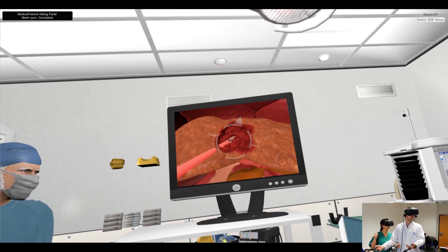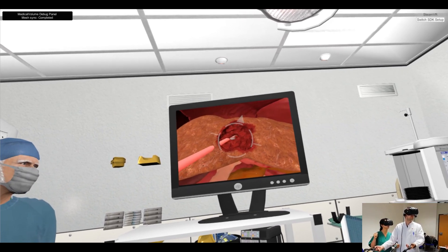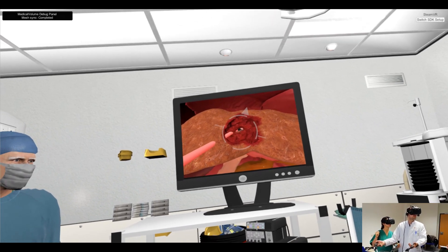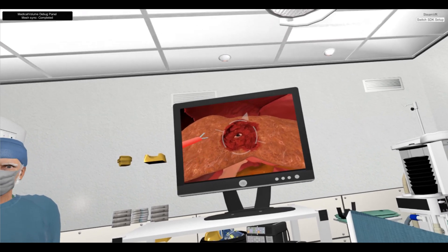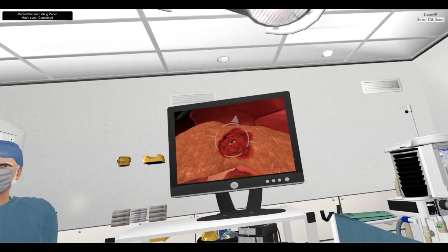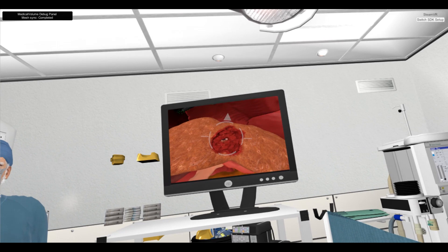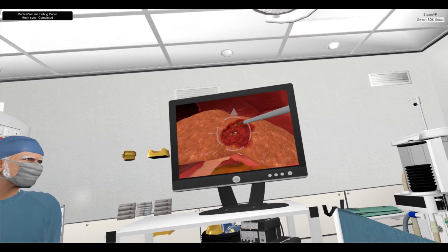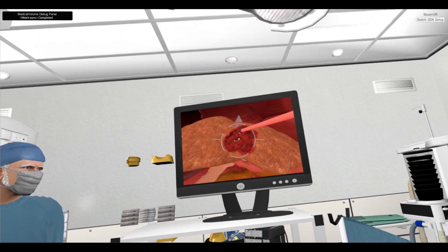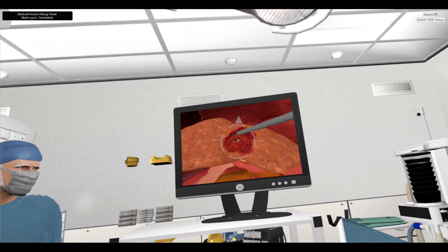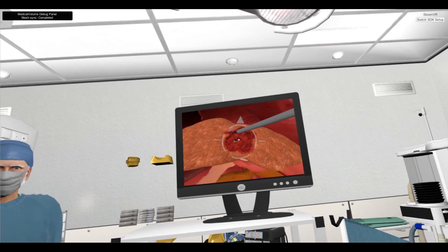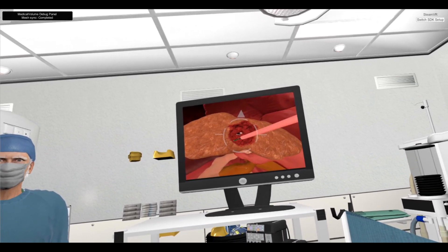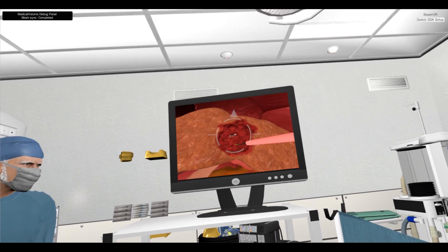In order to complete this task, the user is required to move the grasper instrument to collide on that bleeding vessel and press the yellow button of the foot pedal. Surgeons assess the surgery mode as a good basis for understanding and communication during the surgery. For both modes with collaborative users, the surgeons were positive about our system that provides abilities to explore, interact, and perform the simulation on the patient data.